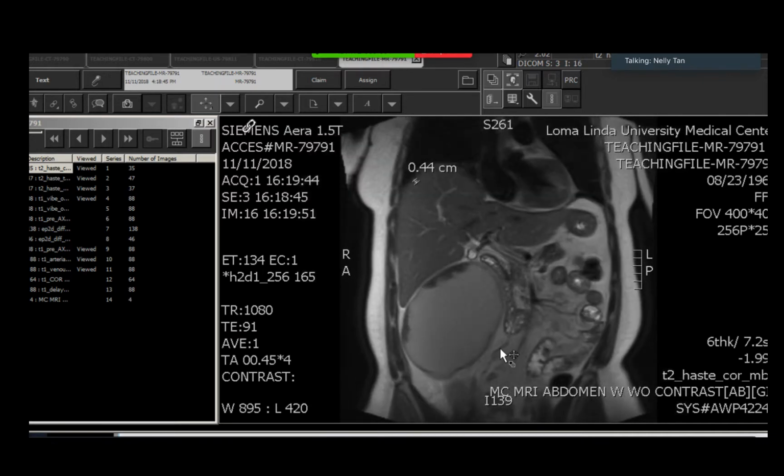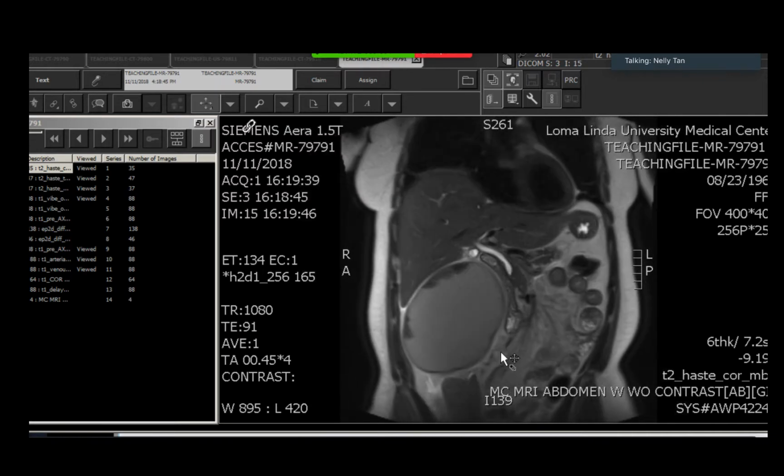But my question was, I thought this was benign looking and chronic in appearance because of the calcifications along the wall. But would you guys feel confident to say, at what point can we tell them this patient does not need surgery? Because I didn't have that confidence, and so I was favoring a benign etiology. But in my DDX, I also said a cystic mass, like a malignant lesion, is also something that I didn't favor as highly, but also in the DDX.